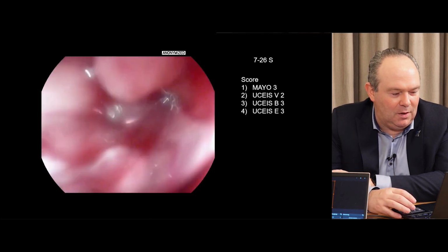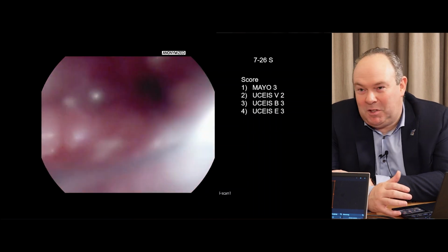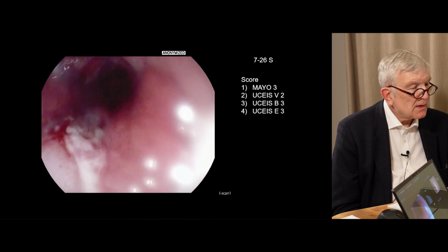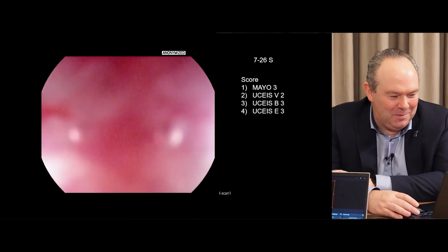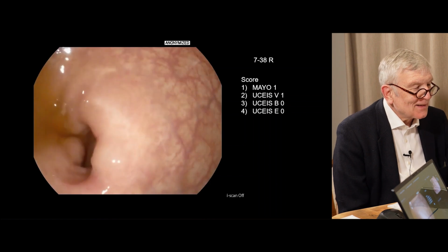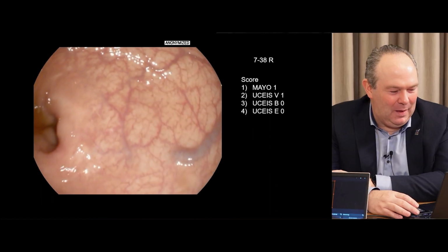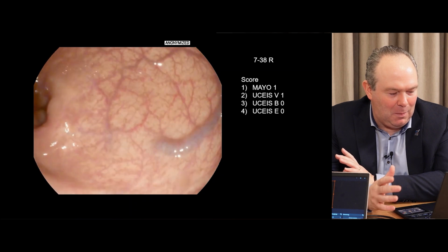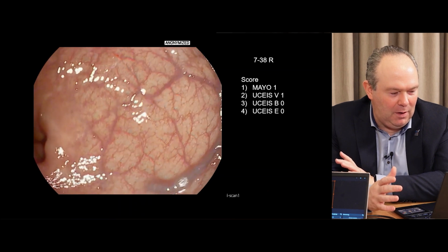All the features are there. So here it's very easy, right, to assess the score. It's at the ugly end, as we said. Exactly. And here the inter-observer agreement is very high. Yes. So there's no doubt here. Again, here, where there's a good correlation, you have some mild erythema. So this is a very mild disease.